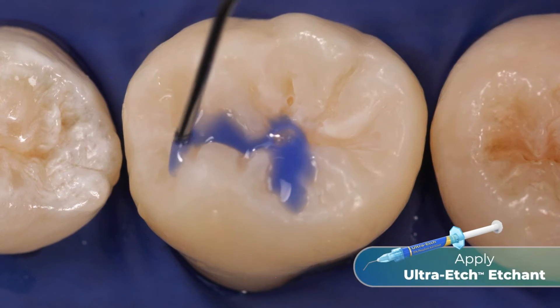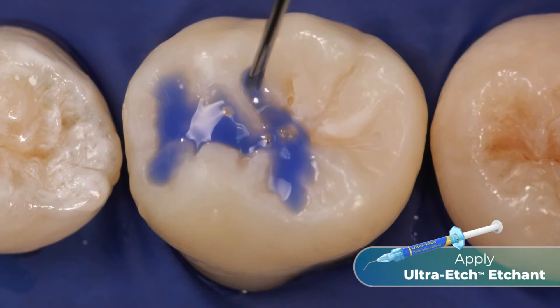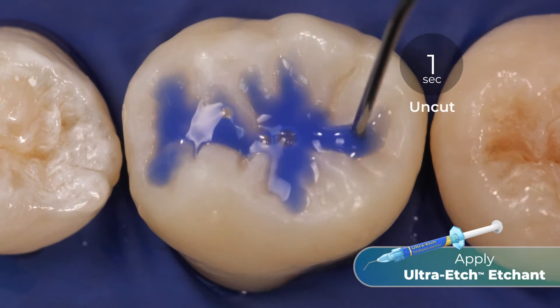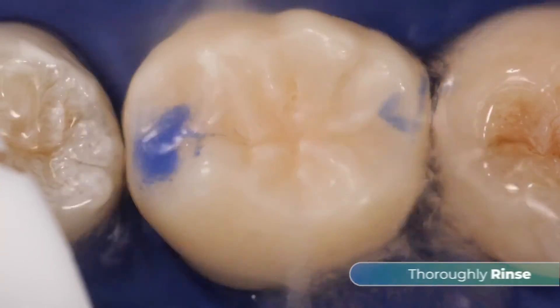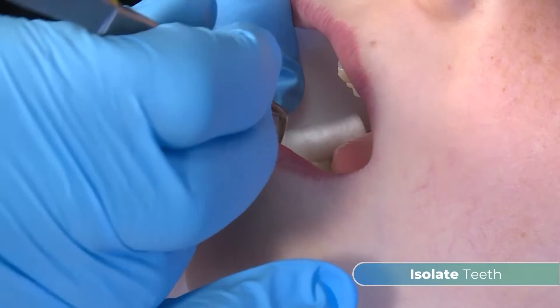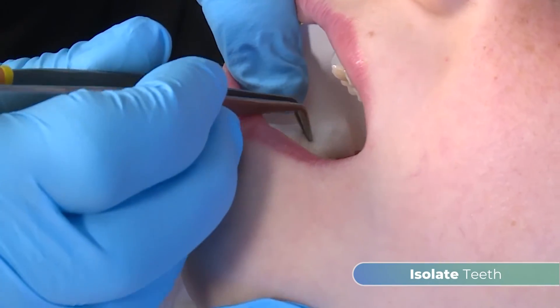Once the tooth surface is prepared, apply Ultra-Etch etchant, a 35% phosphoric acid etchant, to the fissures for 30 seconds on uncut enamel or for 15 seconds on cut enamel. Thoroughly rinse and dry the tooth. Finally, isolate the tooth or teeth being treated to avoid saliva contamination.